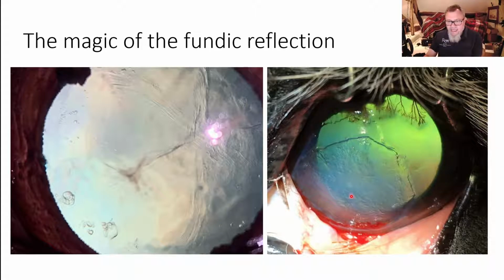You can see that this is an area of vascular cornea that's bleeding from the cut vessels, and by using the tapetal reflection, we can learn lots about what's going on in this cornea. We can see the corneal stromal blood vessels are dramatically highlighted by the tapetal reflection. We can see the edge of the keratectomy very easily, and that light passes nicely through the keratectomy. There's an area here, this white area, where light is passing less freely, which might be an area of corneal infiltrate.